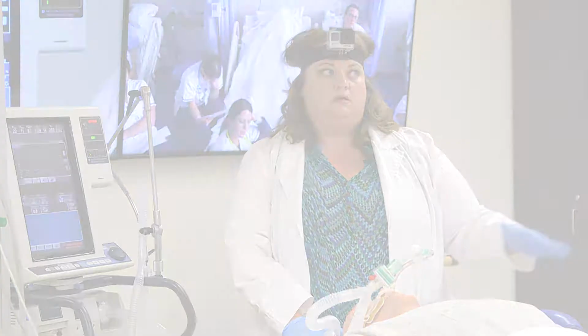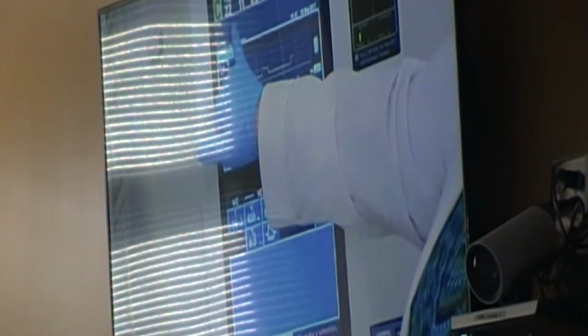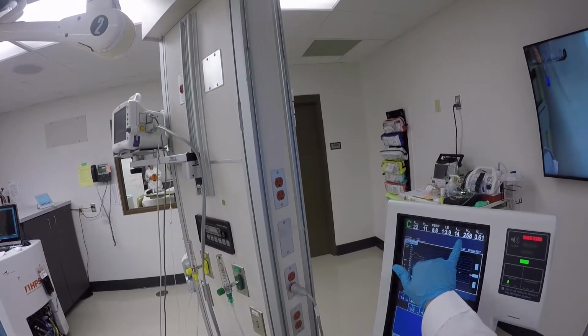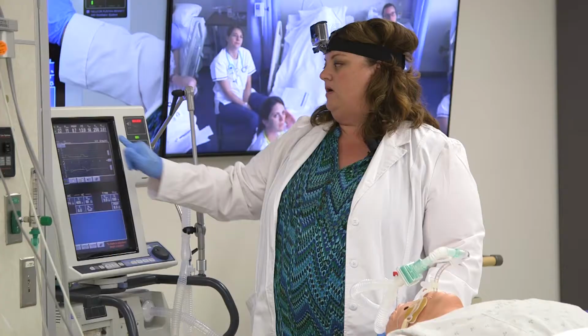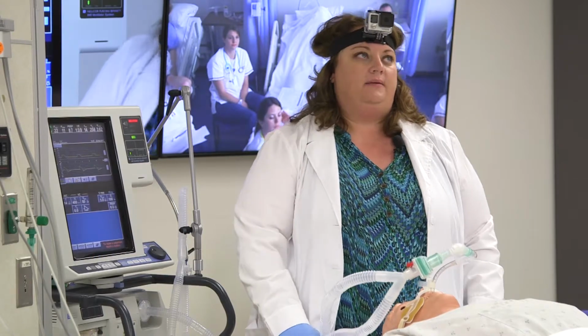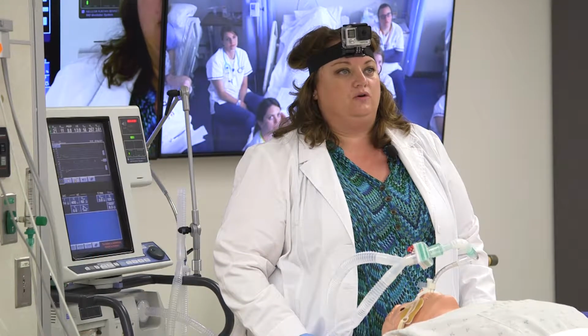It's been obstructed. This is your oxygen, and then your PEEP is set here. The top one is his numbers, so we can see what his peak airway pressures are, what his mean airway pressures are, and then there's a bunch of other ones along here. This is his exhaled volume and his exhaled minute volume, which right now is showing that he has some type of an air leak, because we're not returning the 400 cc's that we're putting in. We're only returning about 260.